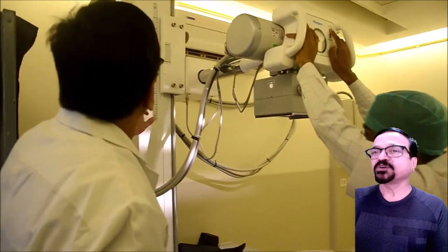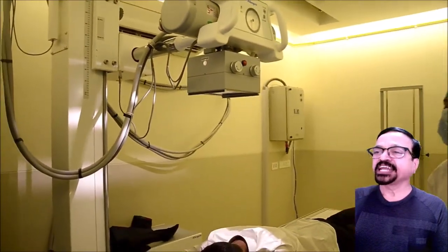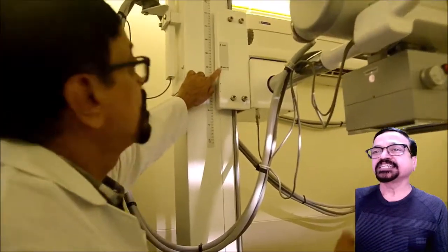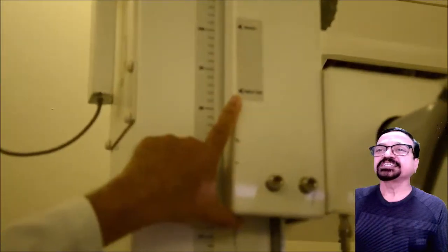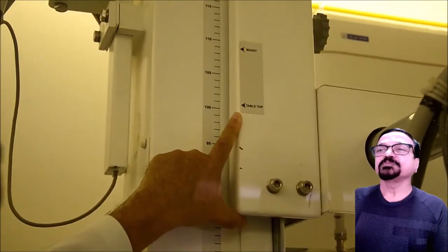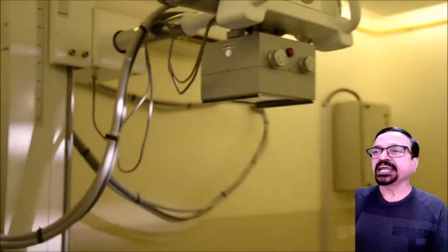Once the collimator is on, the distance is correct, it is verified again, angulation is checked again, and now we are ready for the exposure. Now see, the distance needs to be 100 centimeters. From that, now it is less. Let's correct it to 100 centimeters. Distance from tabletop. Yes, correct. So now it will come to 100 centimeters. So it's correct, and we can go for the exposure.